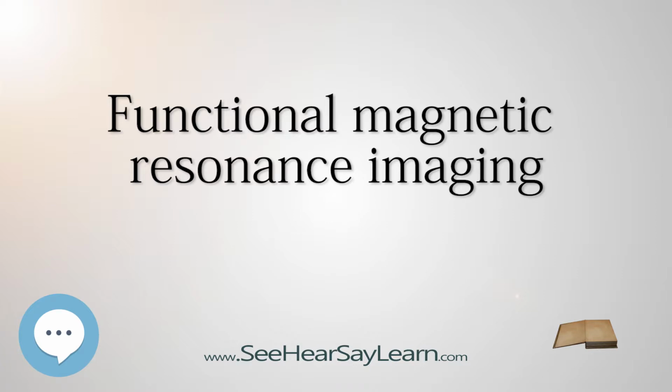For fMRI specifically, the hemodynamic response lasts over 10 seconds, rising multiplicatively, that is, as a proportion of current value, peaking at 4 to 6 seconds, and then falling multiplicatively. Changes in the blood flow system, the vascular system, integrate responses to neuronal activity over time. Because this response is a smooth continuous function, sampling with ever faster TRs does not help; it just gives more points on the response curve obtainable by simple linear interpolation anyway. Experimental paradigms such as staggering when a stimulus is presented at various trials can improve temporal resolution, but reduce the number of effective data points obtained.